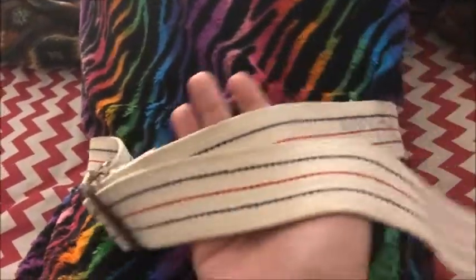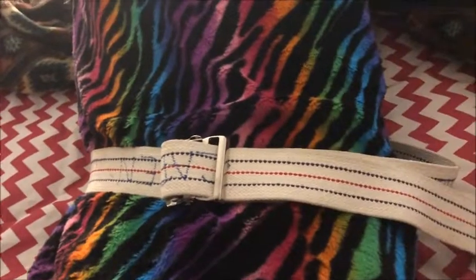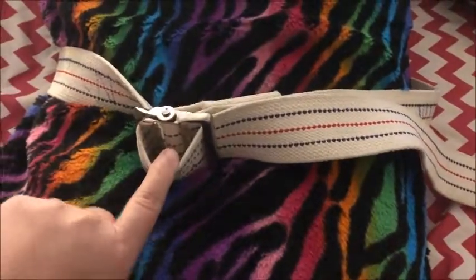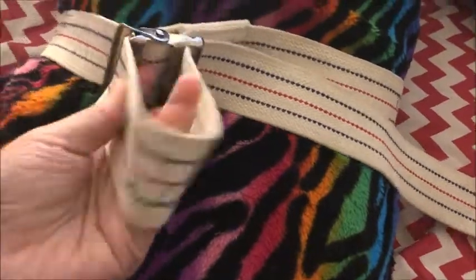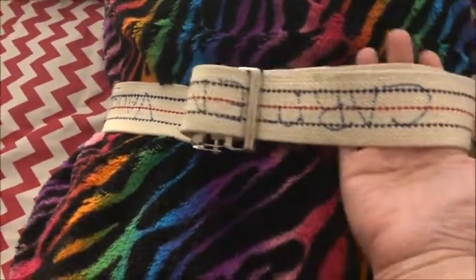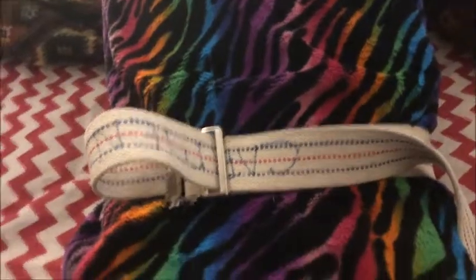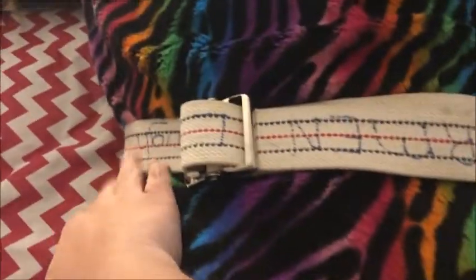You can see over here it's still way too loose. If I was to try to transfer this person, this would still be way too loose. So instead of having to undo this and go back and forth, a really easy trick is to grab this little loop — see how there's a loop right there — and you just pull it. See how it's tightening up? Just pull it, and now it's tighter. As many times as you need to adjust it, you can just pull on this little loop and it will get tighter.